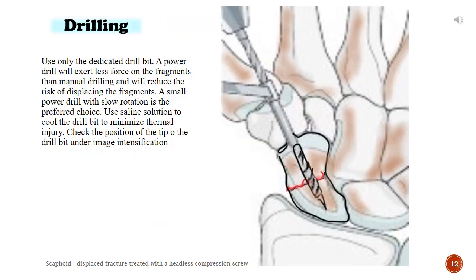Drilling. Use only the dedicated drill bit. A power drill will exert less force on the fragments than manual drilling and will reduce the risk of displacing the fragments. A small power drill with slow rotation is the preferred choice. Use saline solution to cool the drill bit to minimize thermal injury. Check the position of the tip of the drill bit under image intensification.